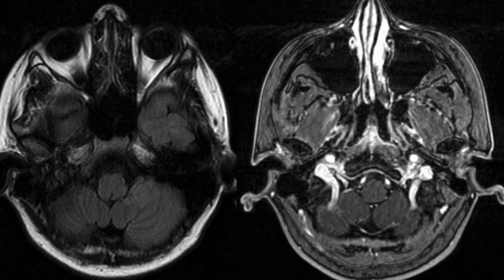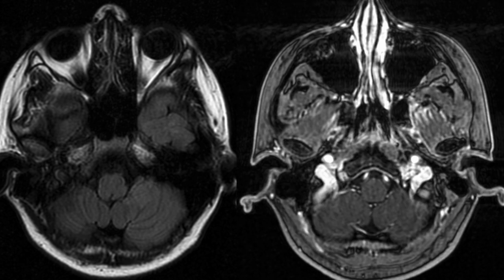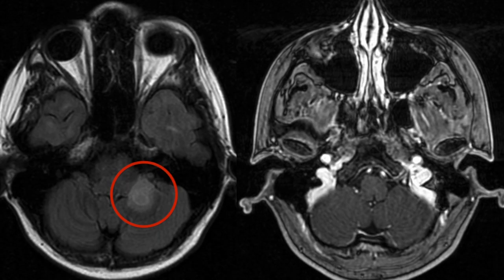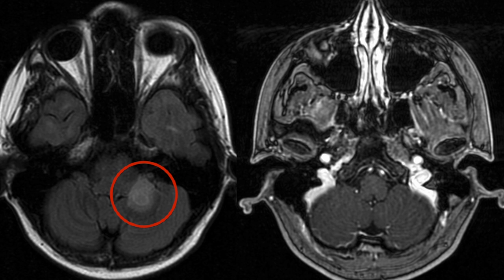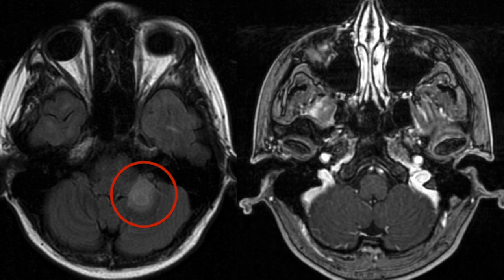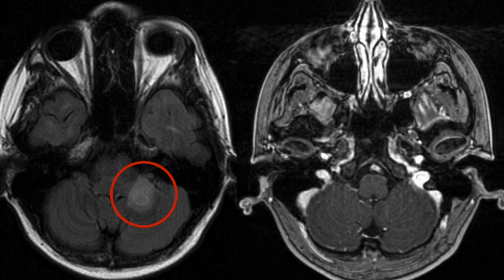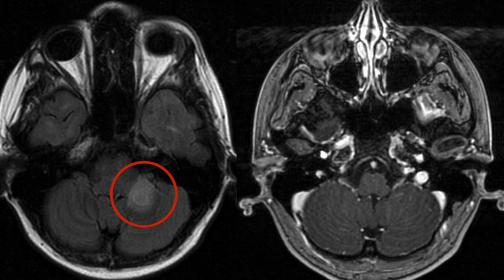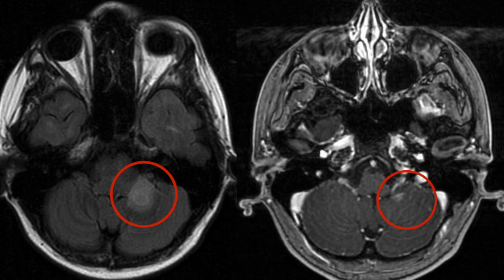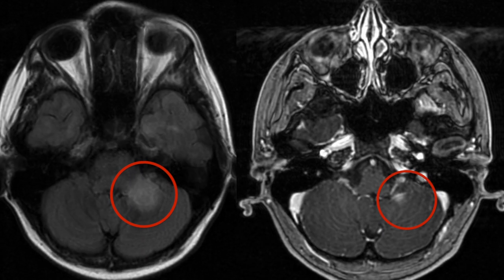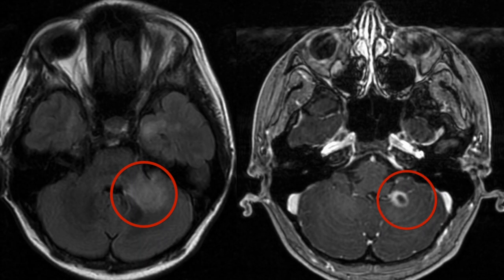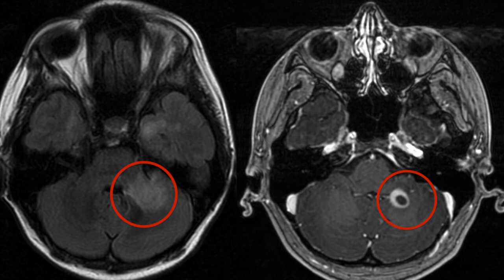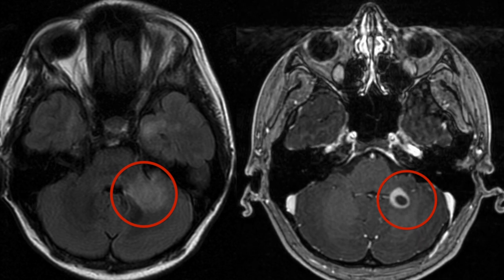As we scroll from the bottom of the brain up, we come across our first concerning lesion which I've circled in red. This part of the brain is called the middle cerebellar peduncle and it's involved in balance and coordination. It stands to reason the patient shares that she was walking around like she was drunk, even though she assures me that she was not.